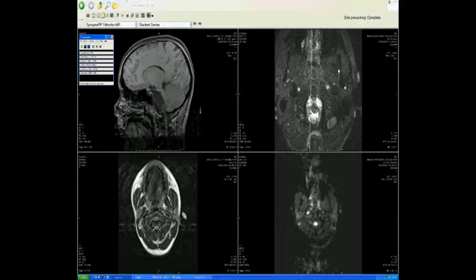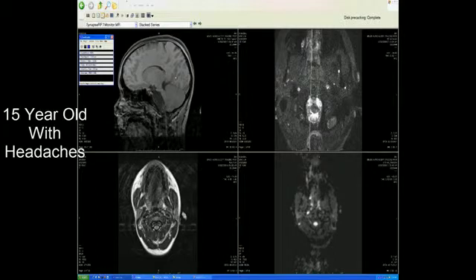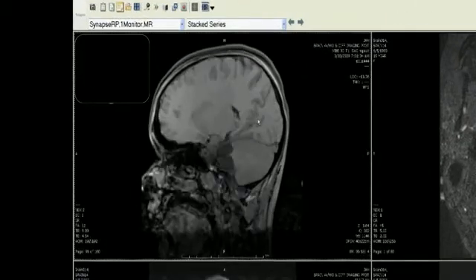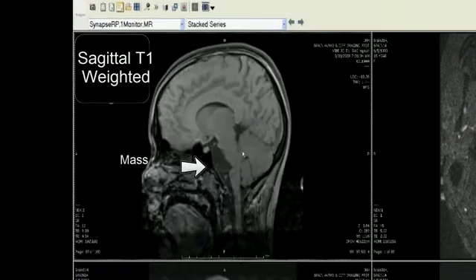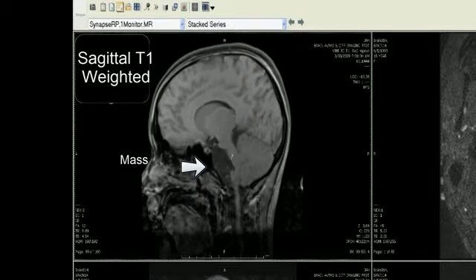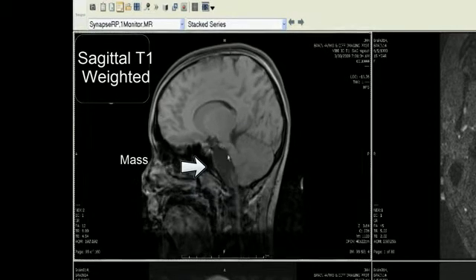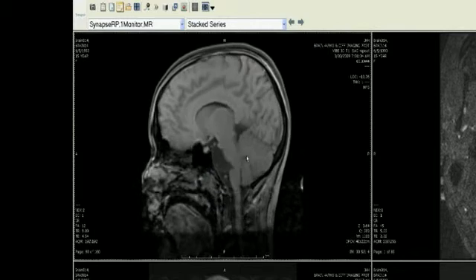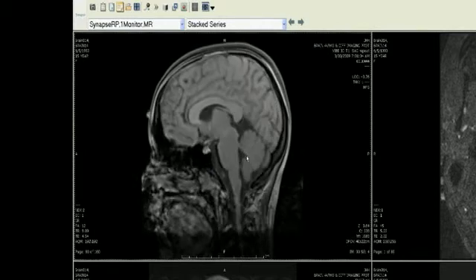This is an example of a 15-year-old child who presented with headaches. On the sagittal T1-weighted scan, we see a mass which is indenting the brain stem and has a somewhat serrated appearance to it on the T1-weighted scan.